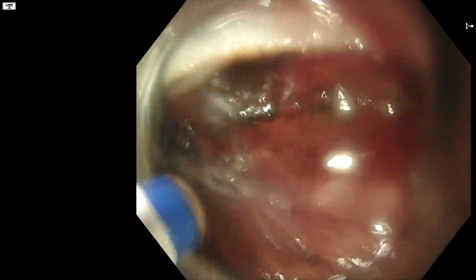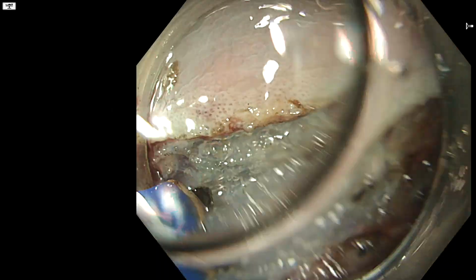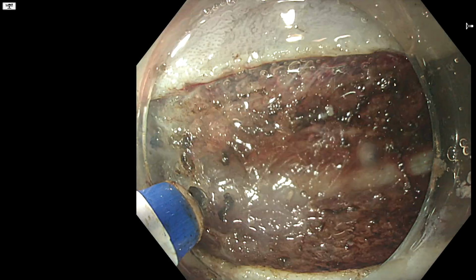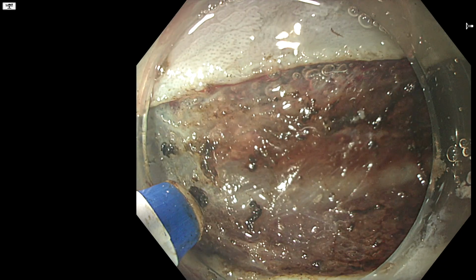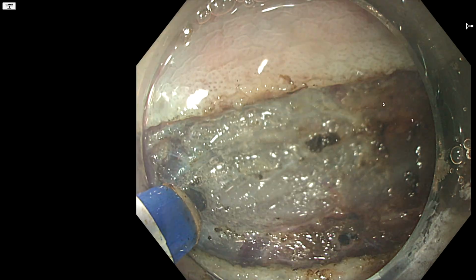Okay, so not the cleanest of incisions, but we finally managed to reach the muscle layer. You can clearly see the circular muscle fibers now. So we're just extending a little bit, and this will provide the exit to the pocket.